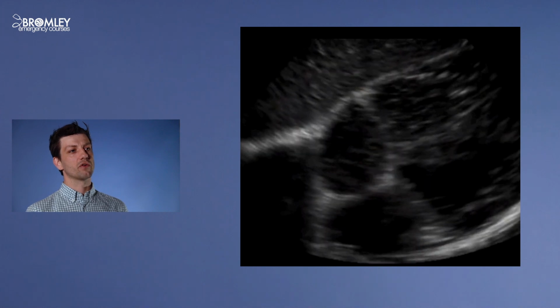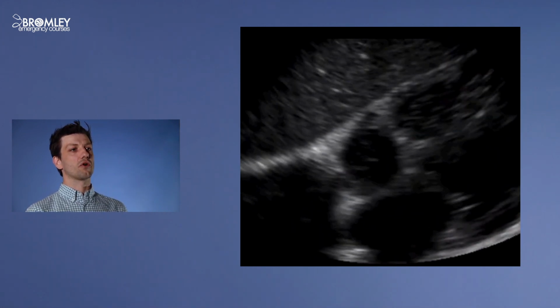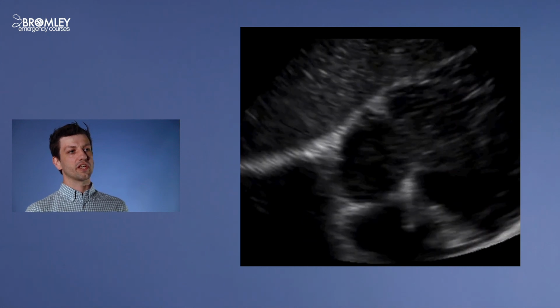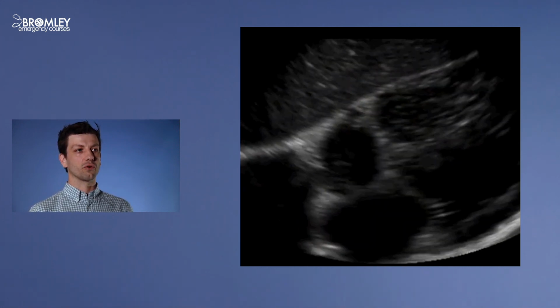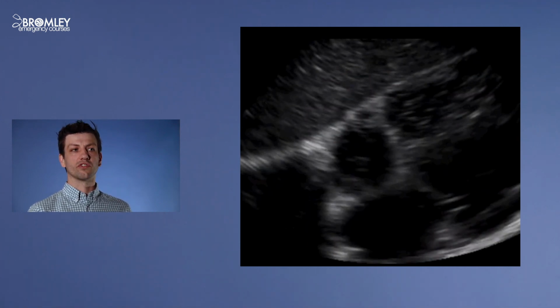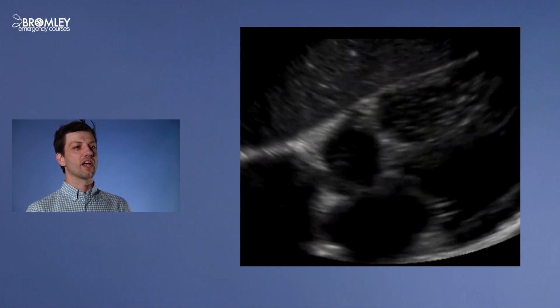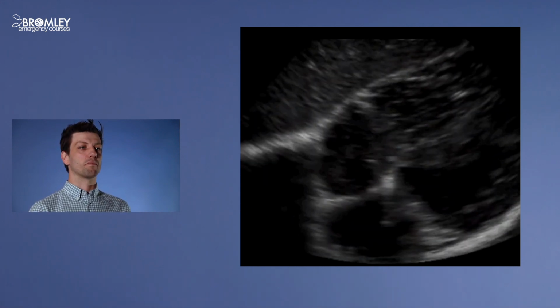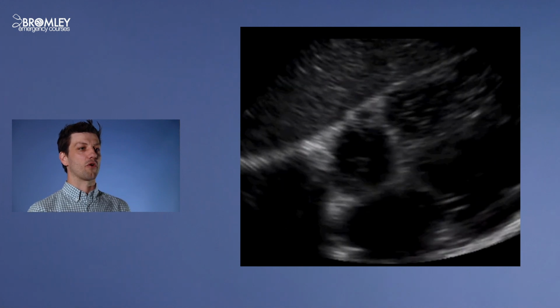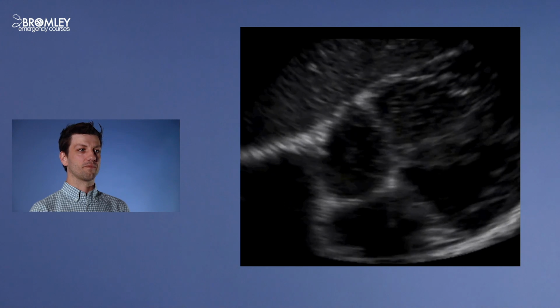Here we see a video of cardiac standstill. We see that the ventricles are not contracting. We do see some bubbles in the right ventricle and the right atrium, and this is either a fluid bolus or a drug bolus being given. The movement that you can see in this video is movement caused by my hand and my manipulation of the probe. There's no organised ventricular activity.